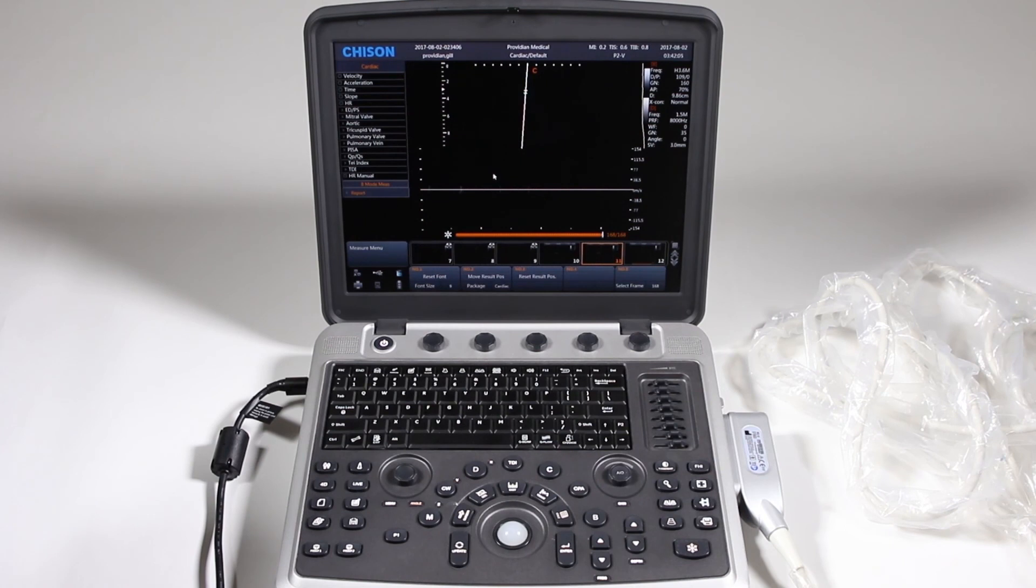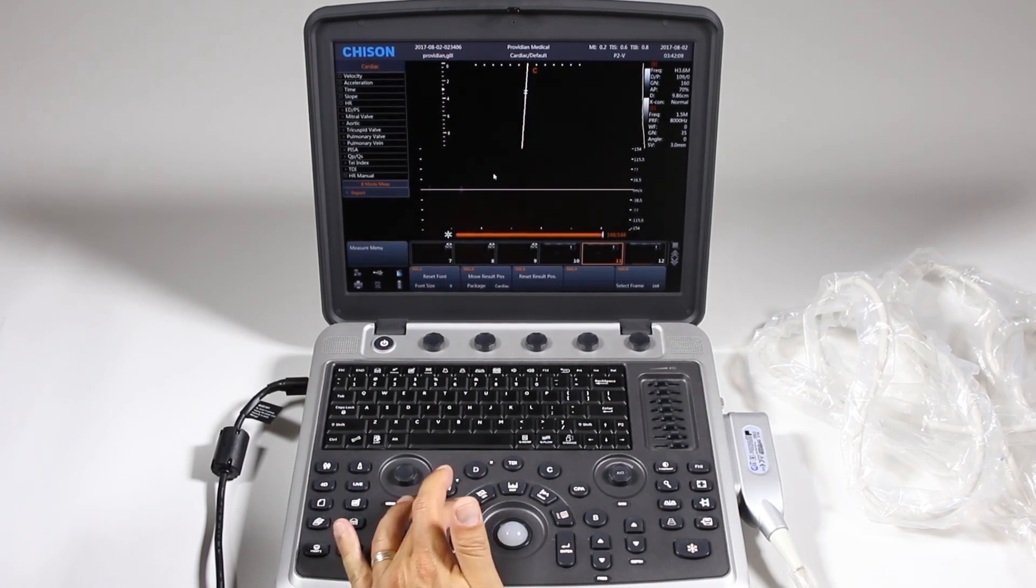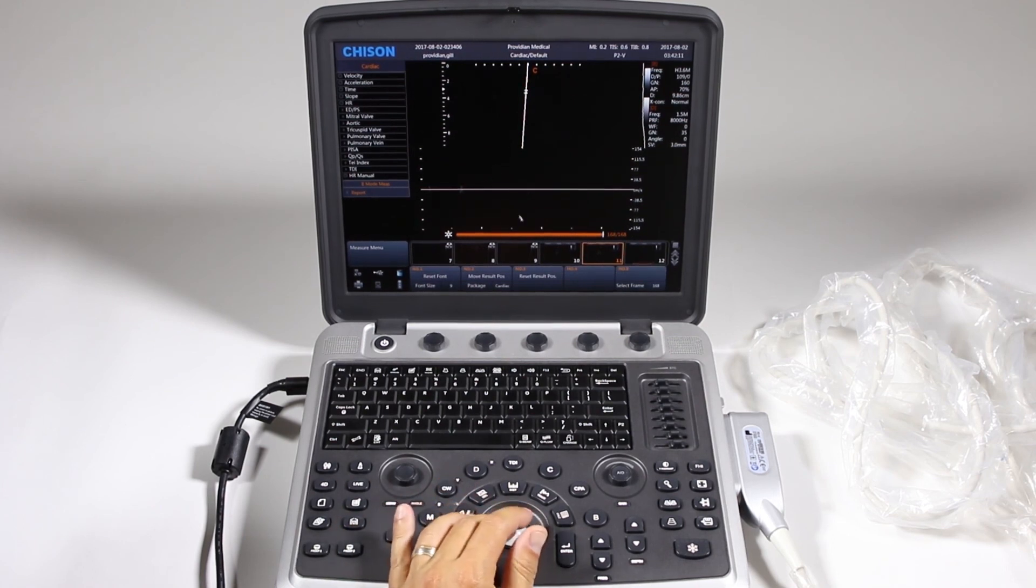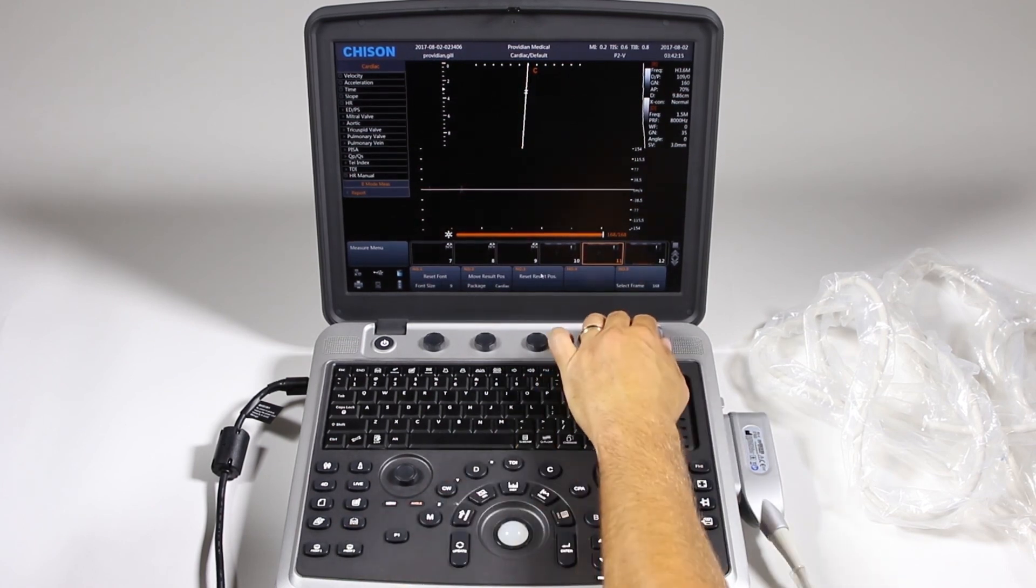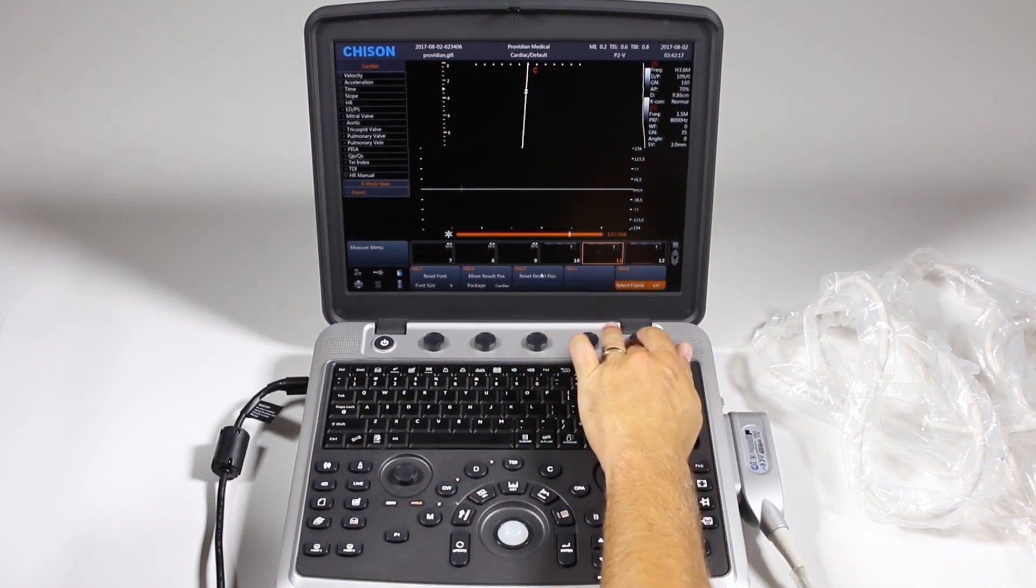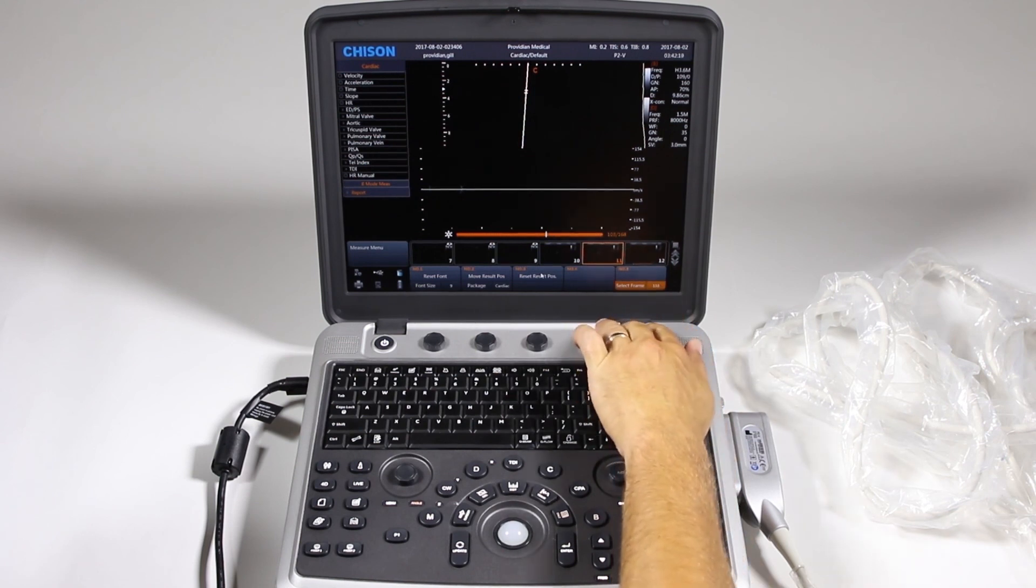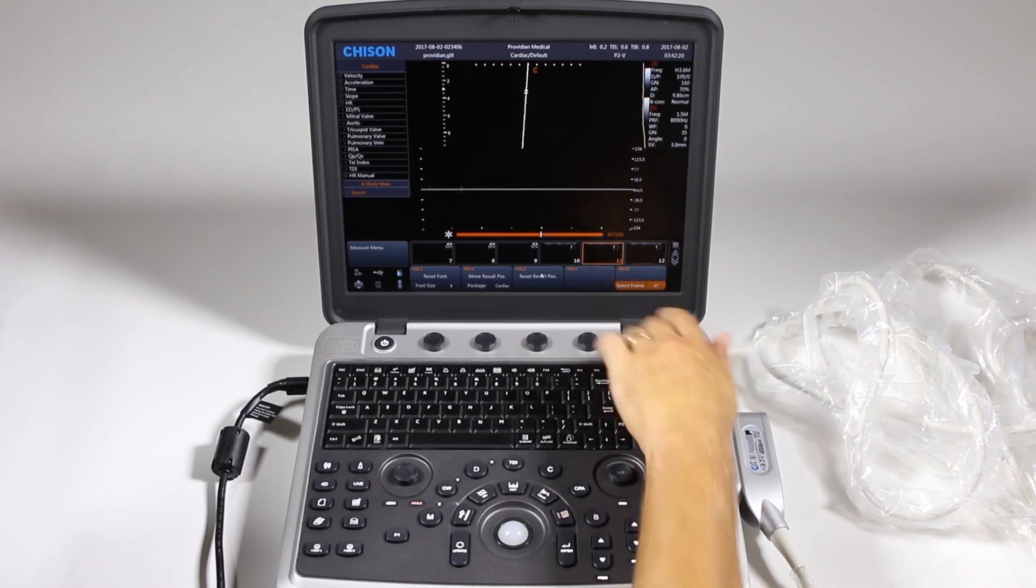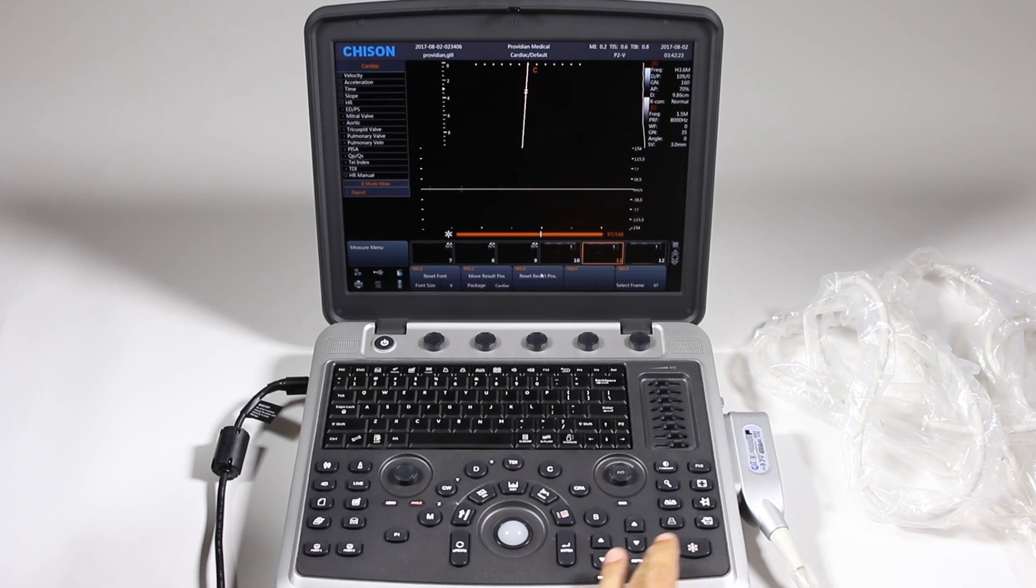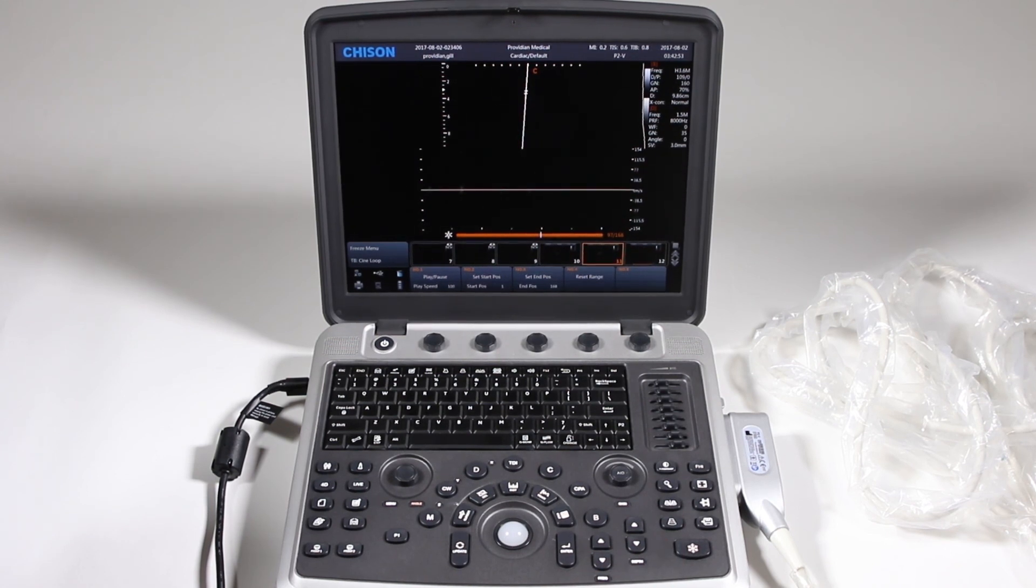Now another item here is when I'm frozen and I hit the calc, you can go back to the Cine Review and change the frame from which you select by just doing the select frame here and scroll back through there. And then you can take a measurement from there. And next we'll get into image review reports and export on your Sonobook 9.